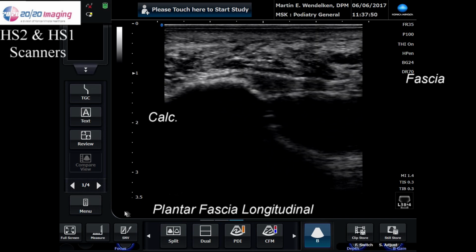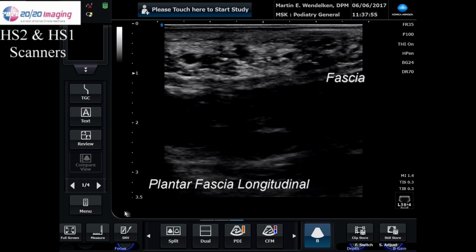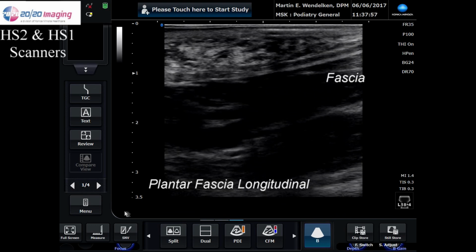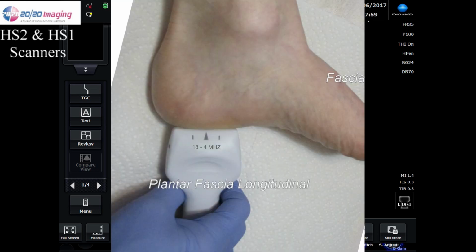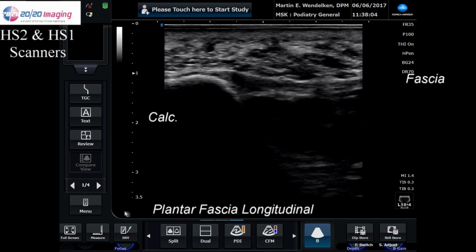Sticking with the plantar aspect of the foot, let's go proximal under the calcaneus, which you see there on the left, the surface of calcaneus, and you'll see the fascial bands, the inferior surface and the superior surface. We go distal, you see following the band as it goes toward the middle of the foot. This is the probe position in the long axis.